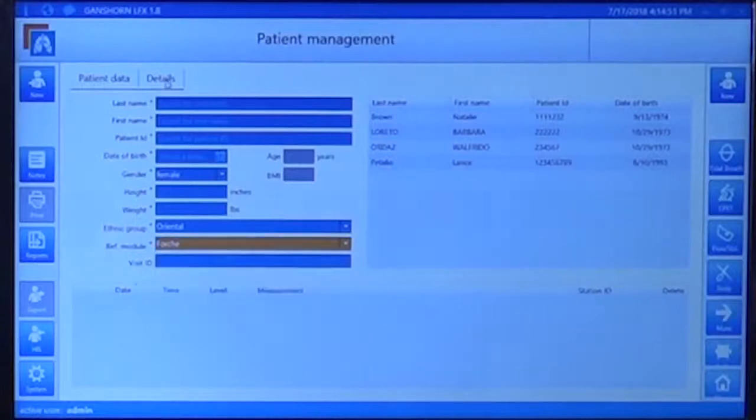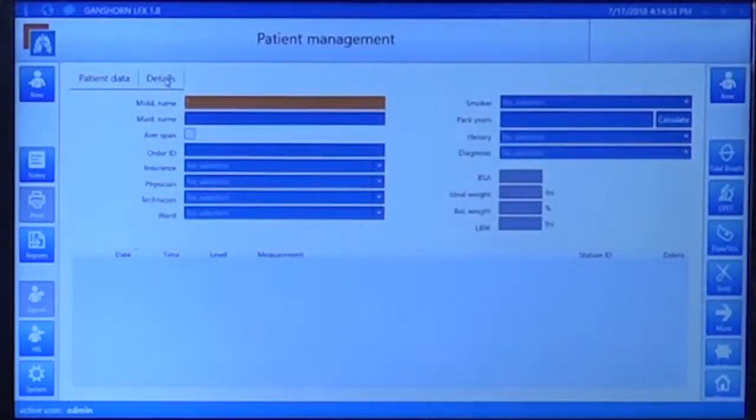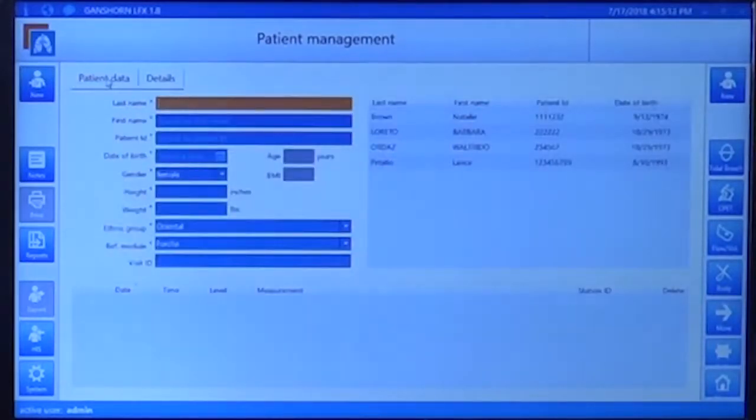There is a second field on the patient ID in which extra information can be put, as for example a middle name, maiden name, order ID, insurance information, ordering physician, technician, etc. that might or not be necessary. For the patient data, only the first field is the one important. To add a new patient, just click on New and you will have a new one.